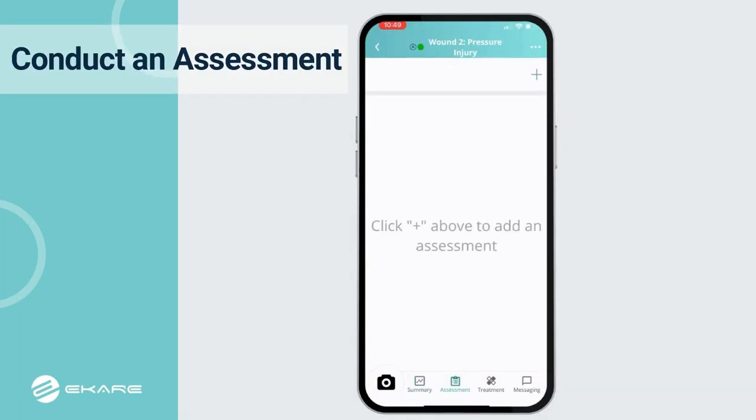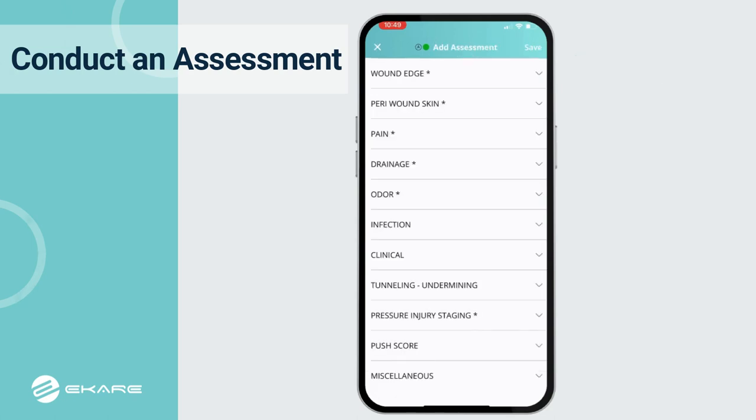Now that the wound image and wound measurements have been captured, the Insight app can be used to document additional wound details. Take a look. Click the plus sign to begin.